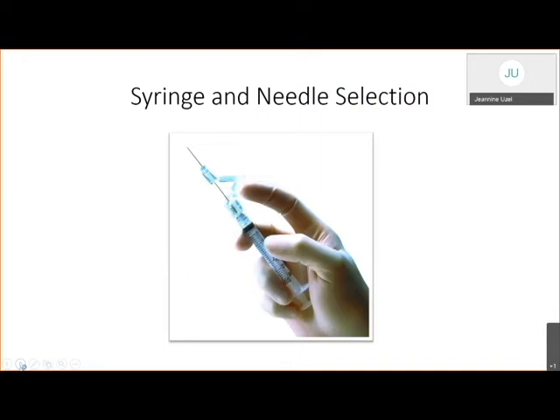Usually a 1 or 1.5 inch needle is appropriate for adults. Typically, vaccines are not highly viscous, so a fine gauge needle, anywhere from 22 to 25 gauge, can be used. As with syringes, some needles are packaged with an expiration date. Check the expiration date on the needle and syringe packaging if present. Do not use if the equipment is expired.